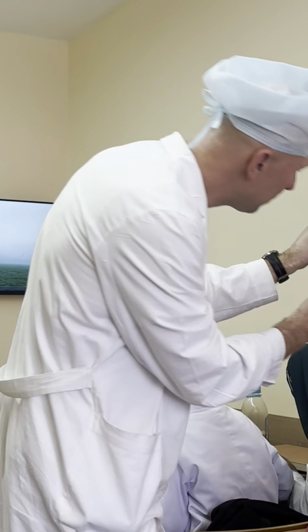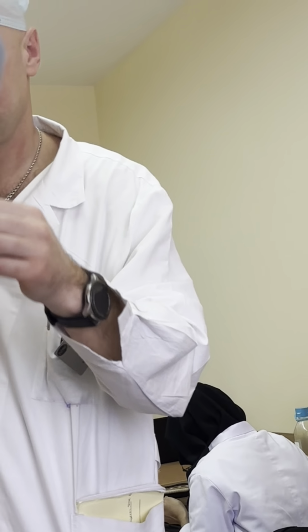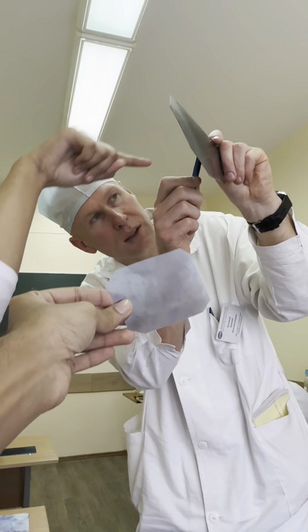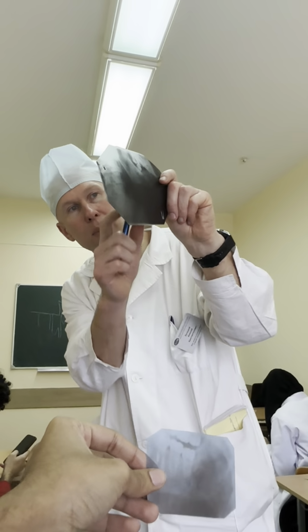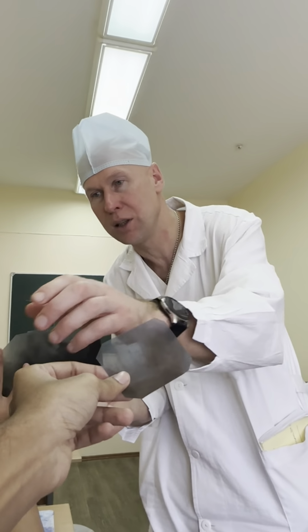No, very easy. Where is the fracture? No. Here. The problem, this is the problems with the mandible. 1, 2, 3 pieces of bone. Maybe defect of the bone tissues and many fracture lines. Severe trauma, maybe accident.